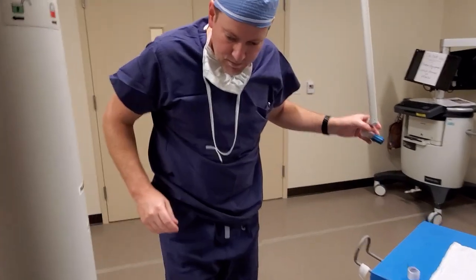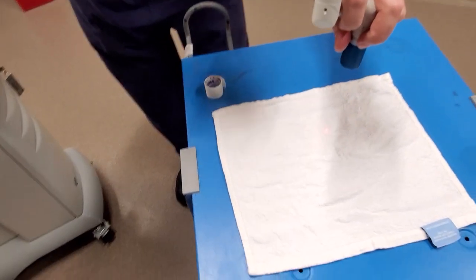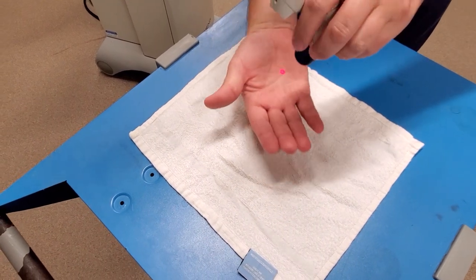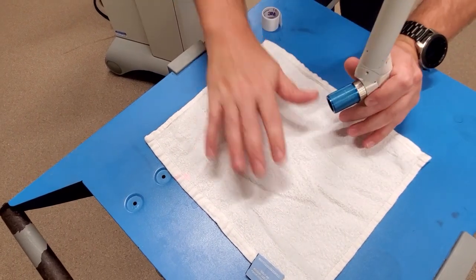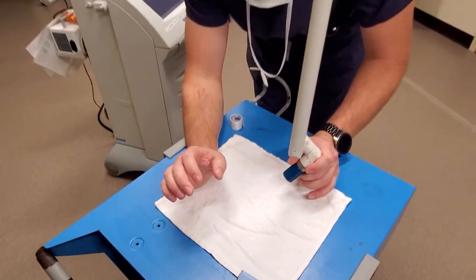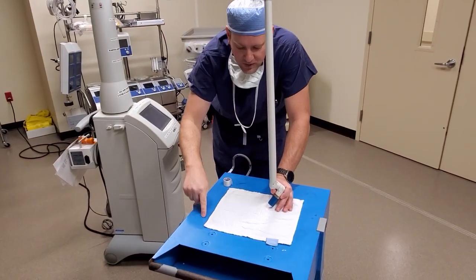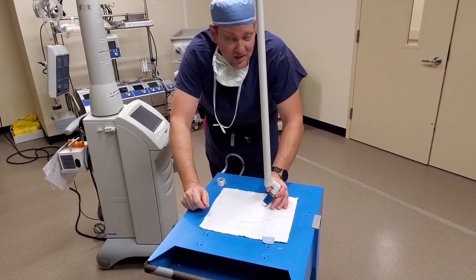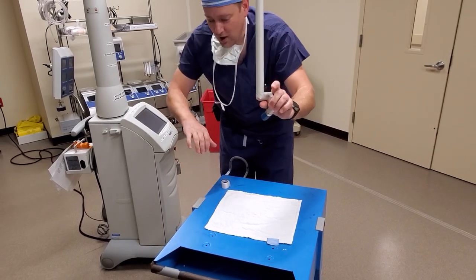Now that our laser is booted up, let's take a look. You'll see right here I have a red aiming dot, but this is not the laser — this is just an aiming dot. CO2 laser energy is invisible; you will not see it, which is also why I have this white cloth right here. In surgical settings, there's a lot of stainless steel. When you have a laser, you always have to wear eye goggles, and also beware that you're not shooting a laser at stainless steel — it bounces all over the place. CO2 lasers are invisible; all you'll feel is a burn.